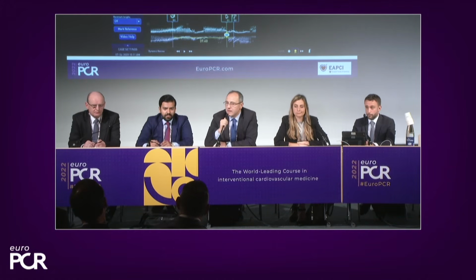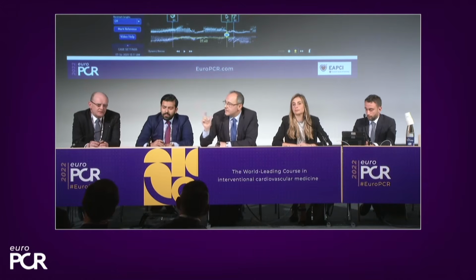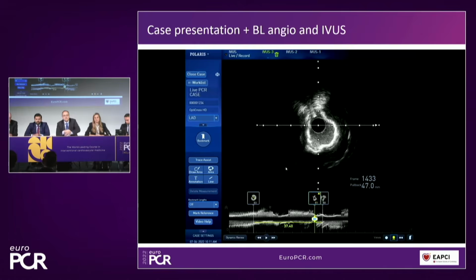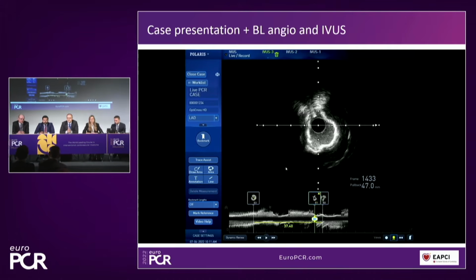Just pure angiographic guidance. What are the challenges we are taking, not doing this procedure with IVUS, Adrian? I guess the first thing I look at is you see the calcium and you decide, am I going to rotablate it? That's my first question. And it didn't look that bad. It didn't look too tight. But rotablation would be my first blind question.